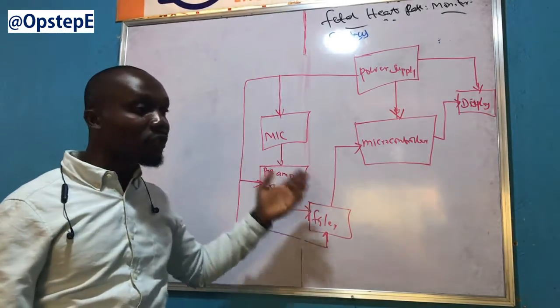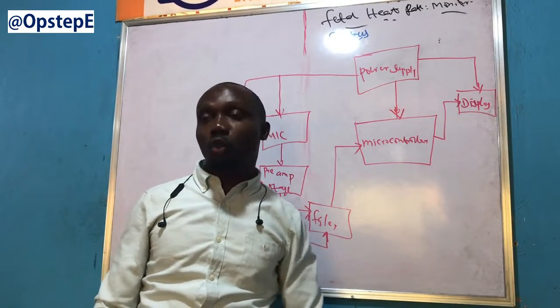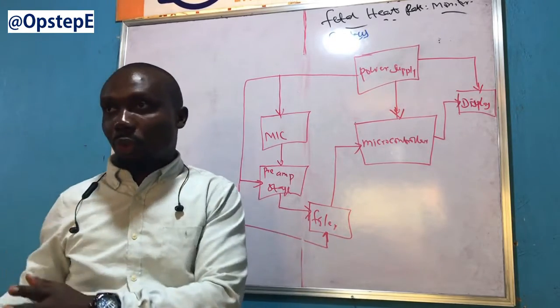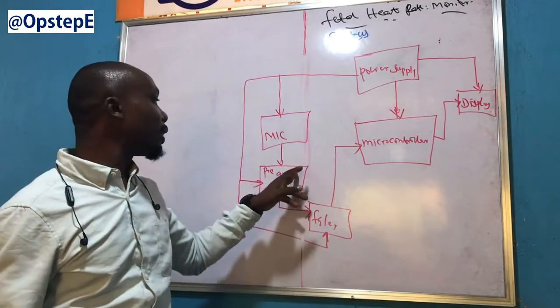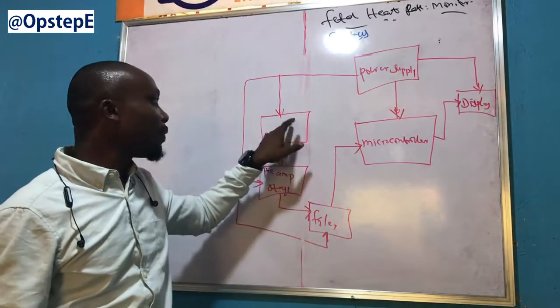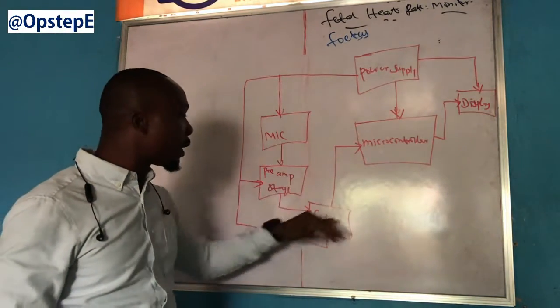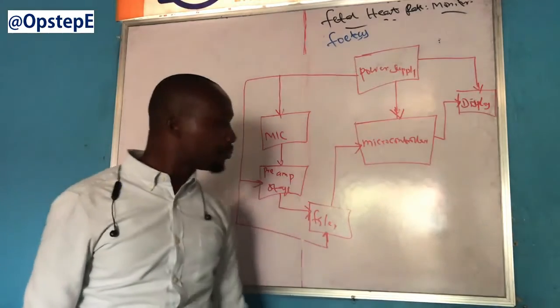The essence of the preamplification stage is just to boost the signal. In audio amplification, what we simply do is multiply the output by a ratio or by a value. You can have a by-10 amplifier system, so that irrespective of what is coming out from here, it's just multiplied by a ratio of 10. That value is then fed into the filter before it goes into the microcontroller.